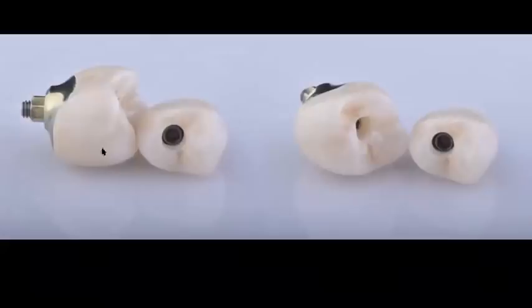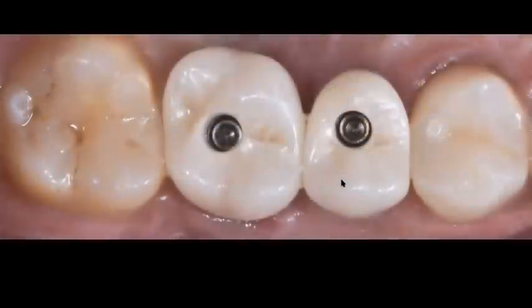And these are screw retained, screwmentable type of restorations, meaning that I have a custom abutment. I have an individual crown that was cemented extraorally with an access hole on the occlusal surface of the crown. You can see that I asked the lab technician to add a little bit of color tint to my restorations to give it more of a lifelike appearance.